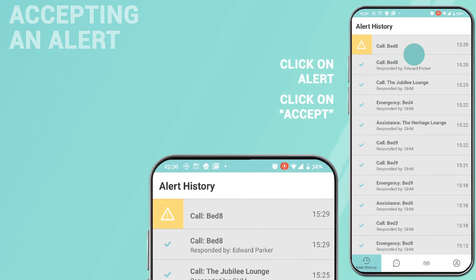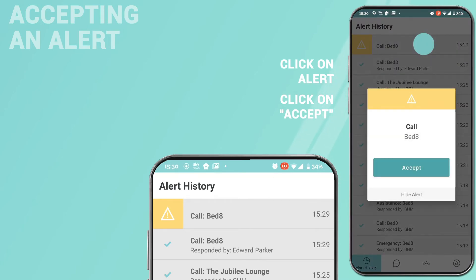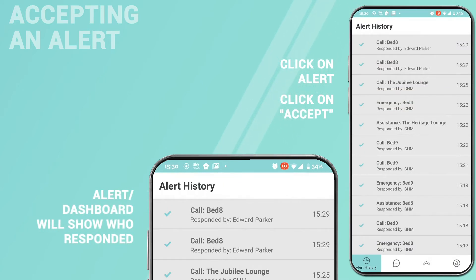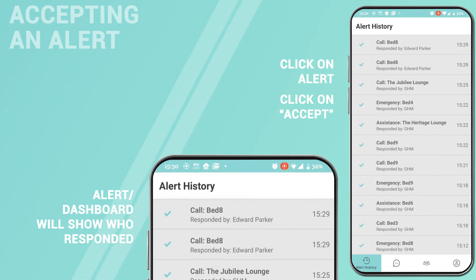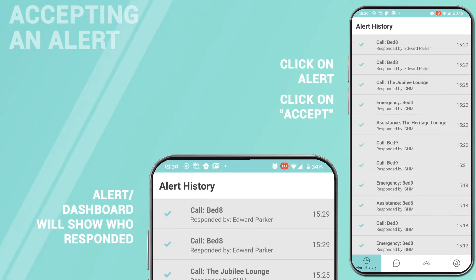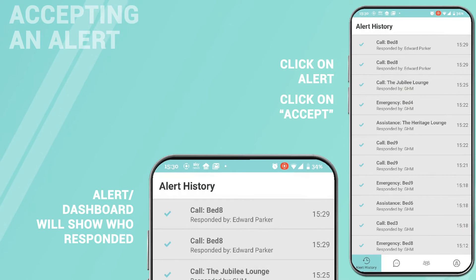Accepting an alert. Alerts are accepted within the app by clicking on the alert and then accept. Once accepted, the app will show the name of who is dealing with the alert. Other phones will show the alert as responded to. The alert still needs to be cleared down at the point of call. If this is not done, the alert will be re-sent by the nurse call and reappear in Nexus.